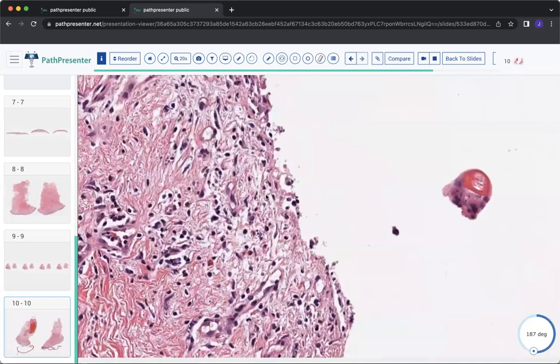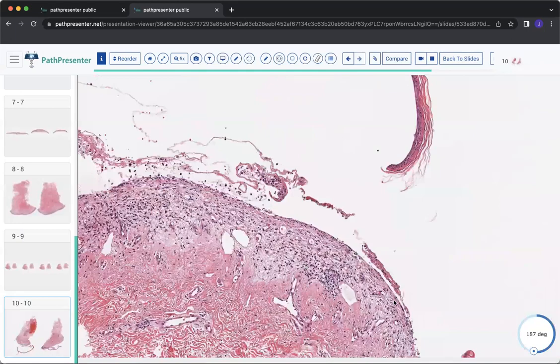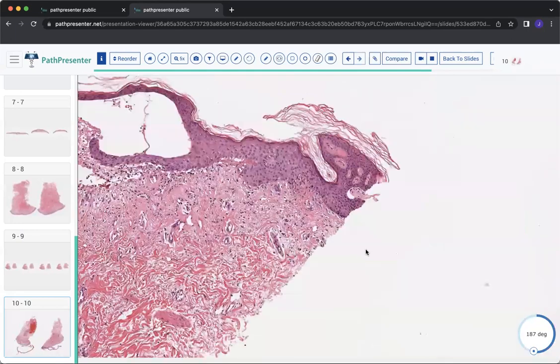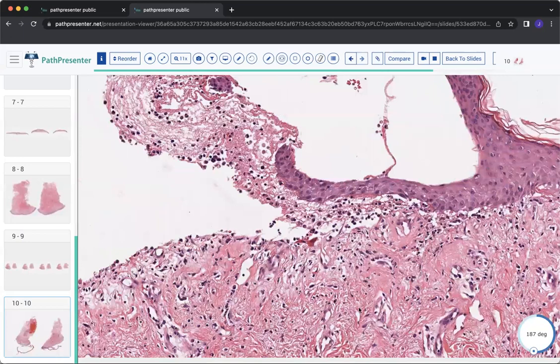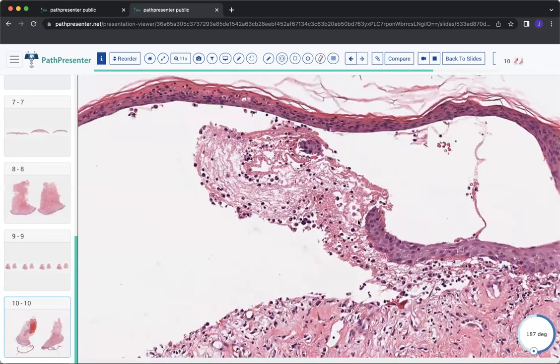So this example is impossible to get right 100% unless you're given answer choices that absolutely would not fit, and they only left bullous lupus as the remaining one that made sense because it's subepidermal. You don't have a lot of eosinophils. But if they gave you bullous pemphigoid, they gave you EBA, they gave you bullous lupus, it could be pauci-inflammatory or low eosinophil bullous pemphigoid.